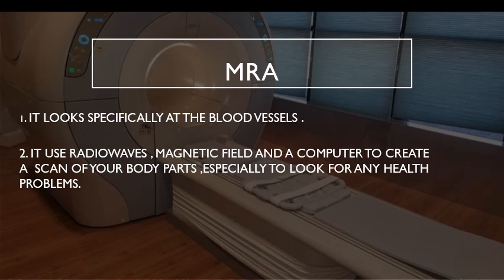So, in MRA, this test uses radio waves, a magnetic field, and a computer to create a scan of your body parts, especially to look for any health problems.